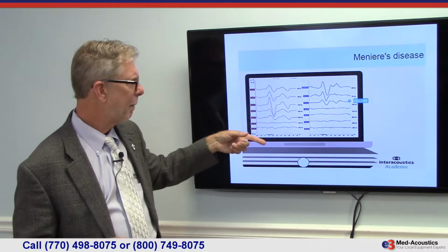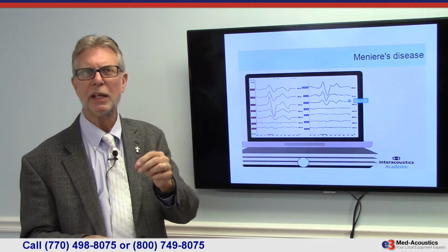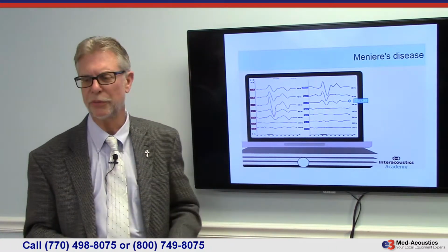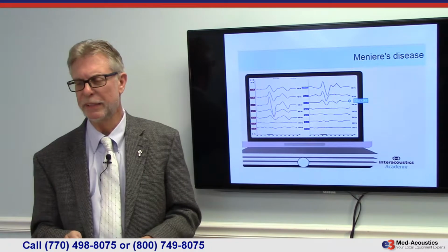However, in the case of Meniere's, you do it at 500, you do it at 750, and now the response has a higher amplitude at 750. Do it at 1,000, it has the highest amplitude, and it doesn't start to reduce until you get beyond 1,000. And there's still a response present at 1,500 even.